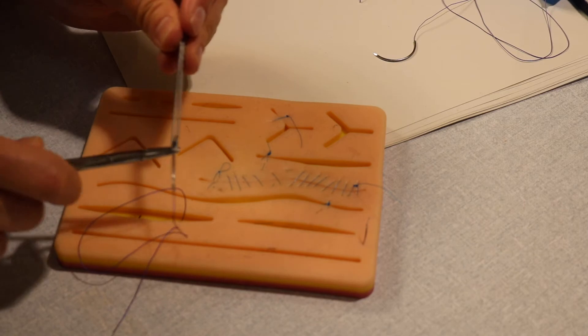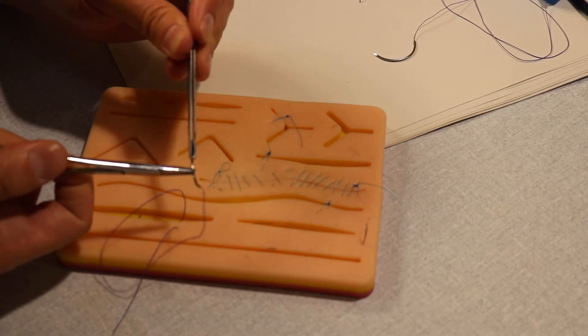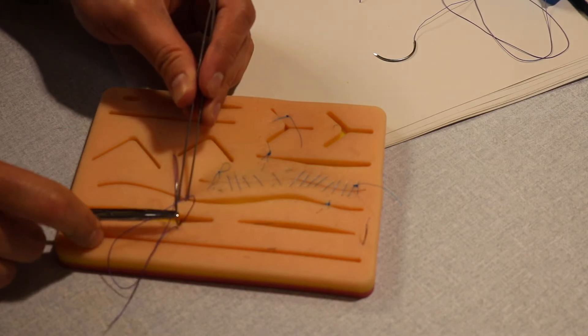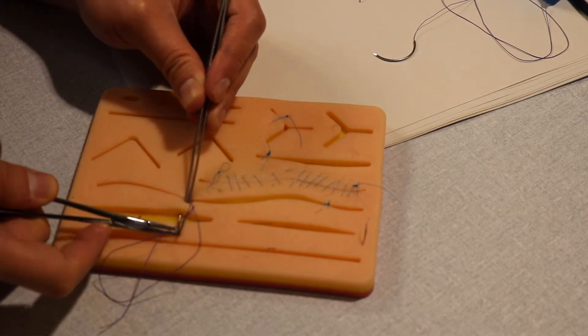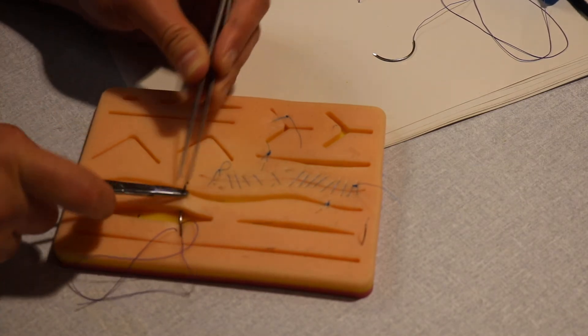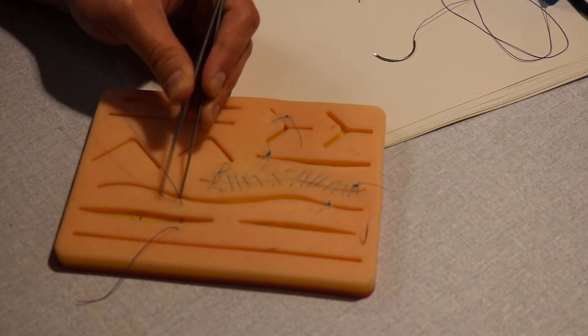Mount the needle holder again. Go, you need to go perpendicular to whatever you're going on. And now I'm on the other side. Rotate, pick it up, and bring it to the other side.